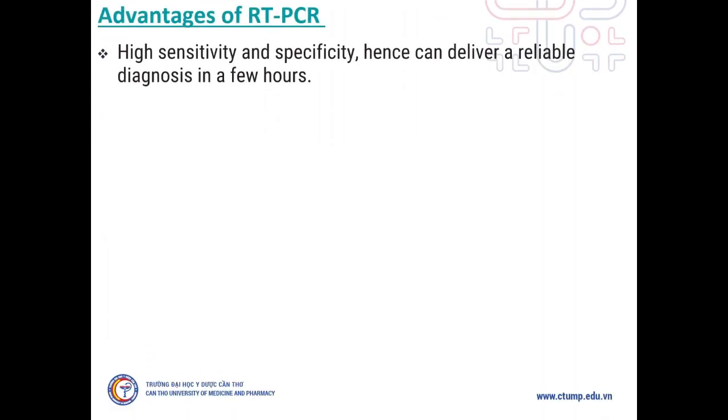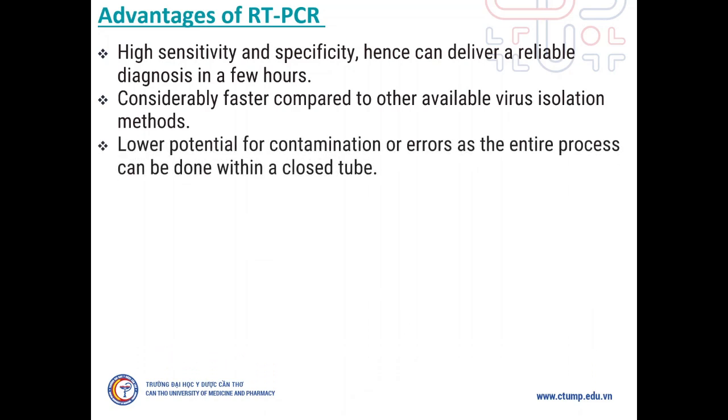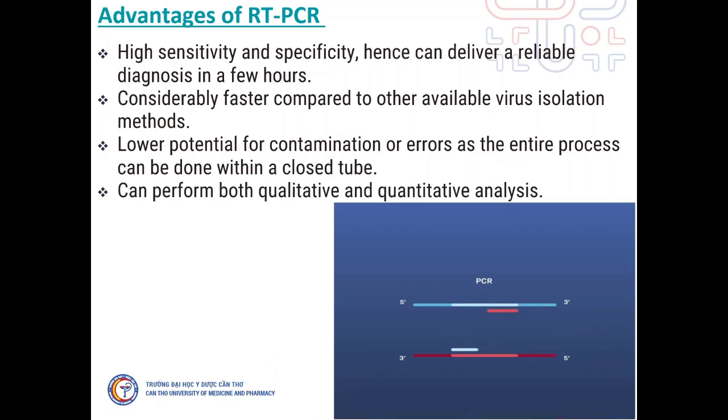Highly sensitive and specific, it gives the result within a few hours, faster than other methods, with lower contamination and errors. It can be used to do both quantitative and qualitative analysis.